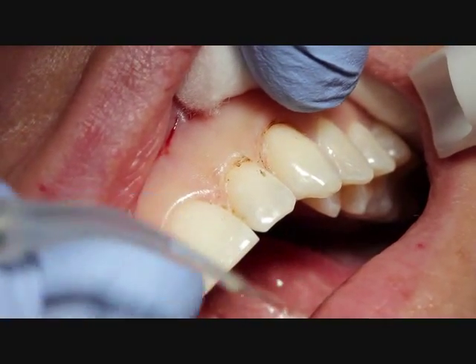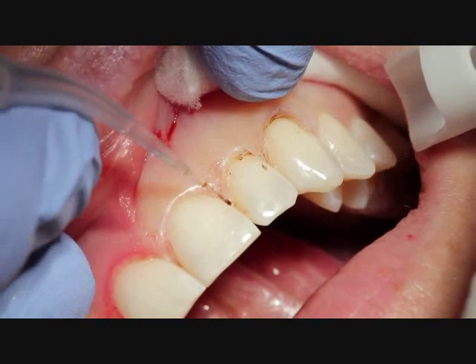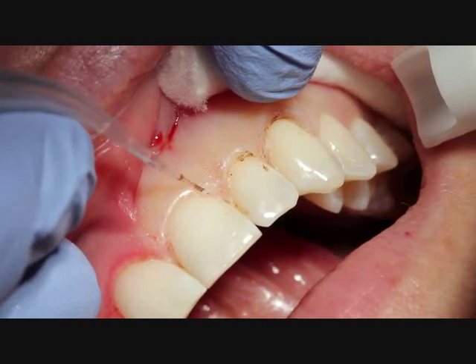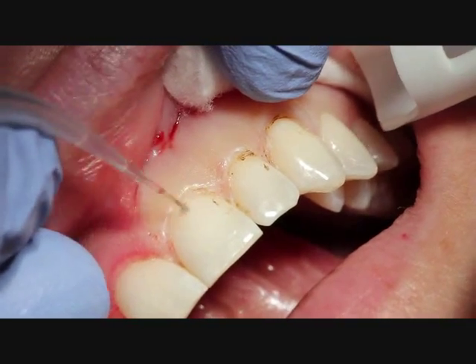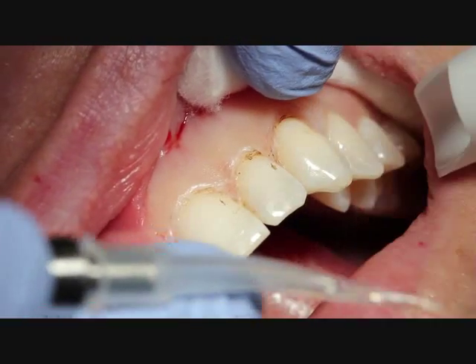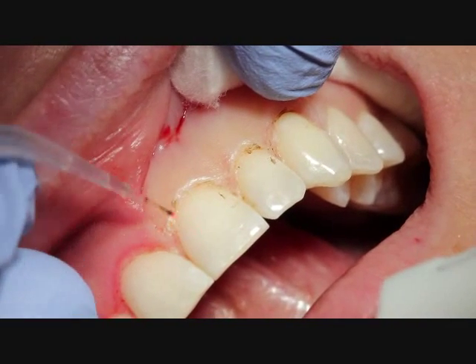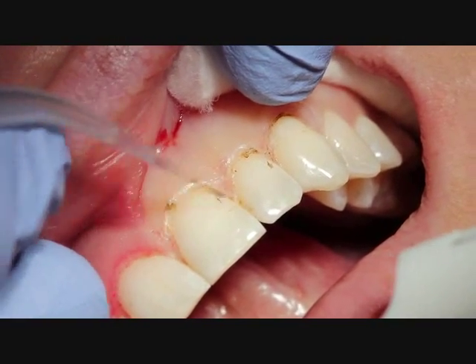As we get over to the central, you'll notice that the other central, number 8 — we had done the opposite side the day prior. Just because the patient had a time constraint, we had to have her come back and we could only do one area at a time.